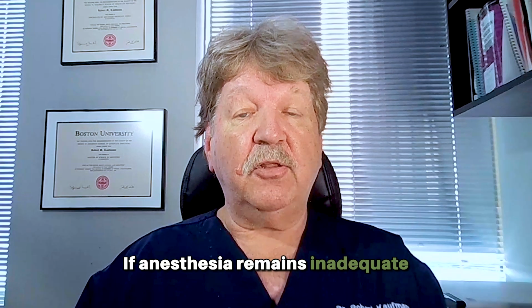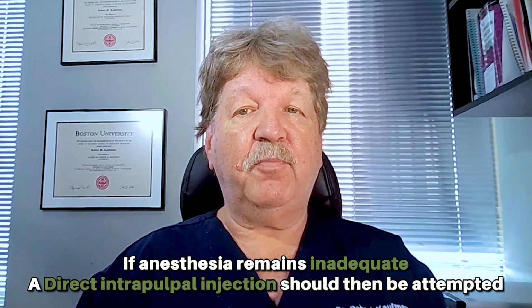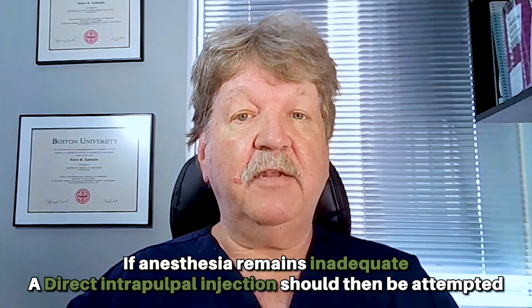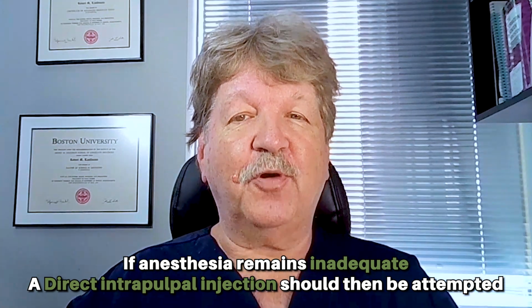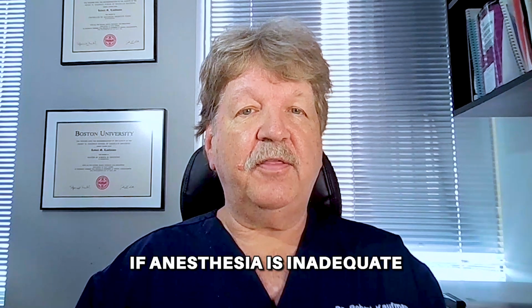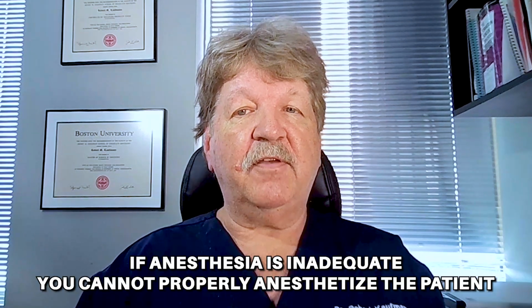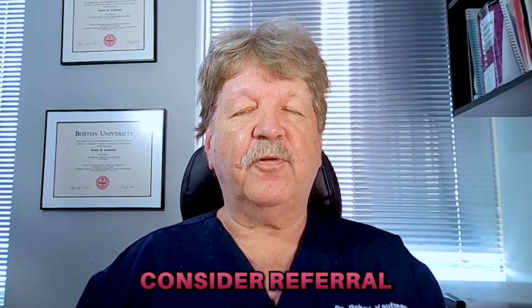Should anesthesia still not be adequate for us to continue with treatment, a direct intrapulpal injection should then be attempted. It is the injection of last resort. You can find information on how to do this by checking my other Beyond the Terminus video that deals specifically with the intrapulpal injection. As with any case, should you find that your anesthesia is inadequate or you're simply unable to properly anesthetize your patient, consider referral.